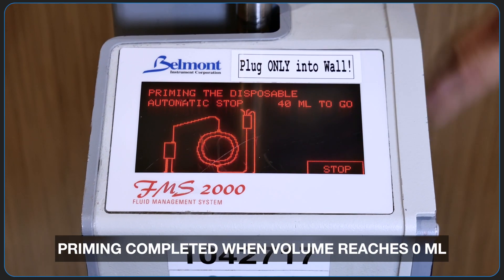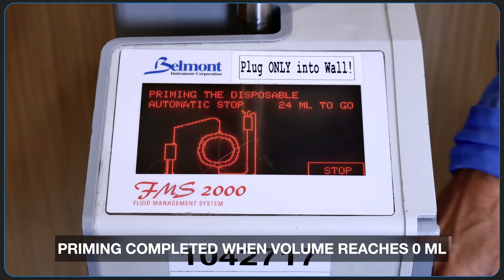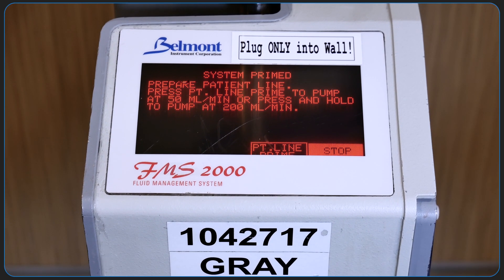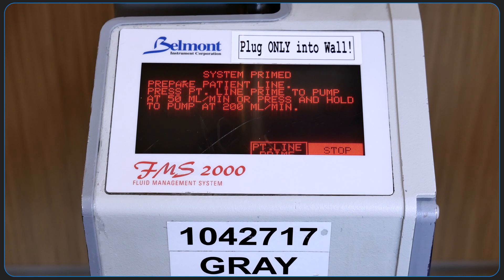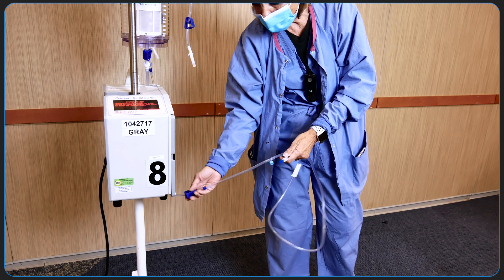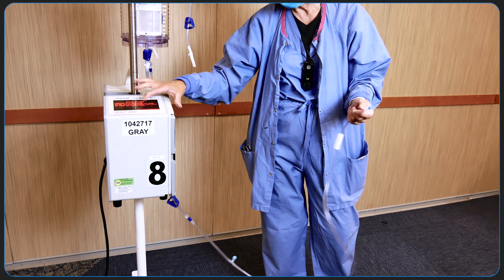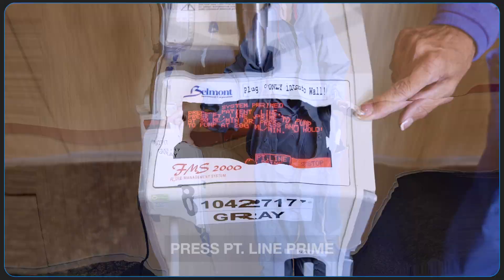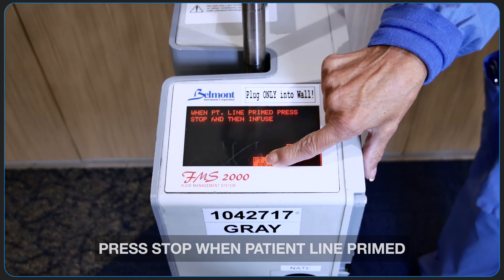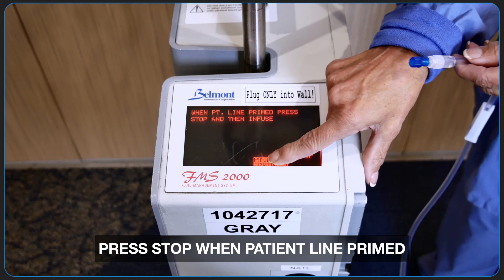You can see a prime volume countdown displayed, and priming is completed when the volume reaches zero. Next, the patient line also needs to be primed. This is a vital step to ensure that the patient line is completely free of air. To quickly prime the patient line, press and hold the patient line prime button. As soon as the patient line is primed and no air is visible, hit stop.